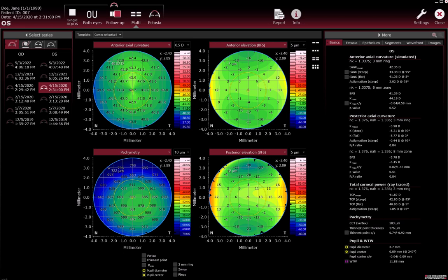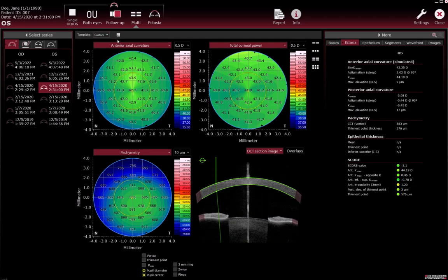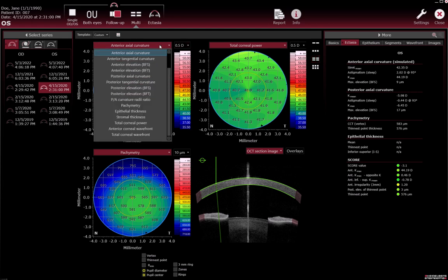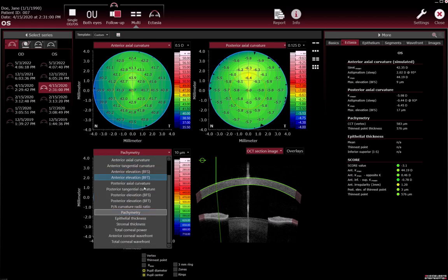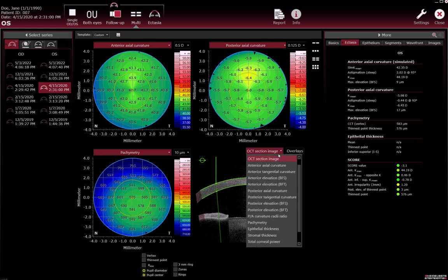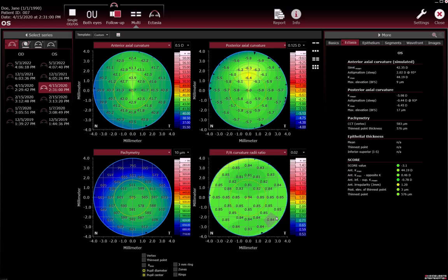Templates can also be created and saved. Select how many maps should be displayed in the template. To change a colour map, open the drop-down list above the desired colour map and select the desired colour map, camera image, or OCT section image.